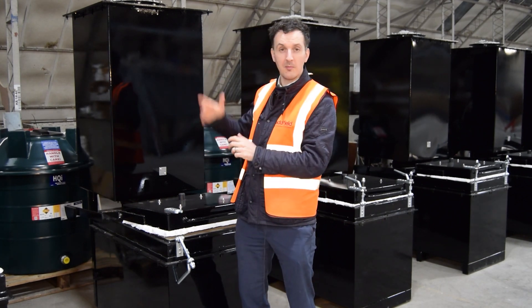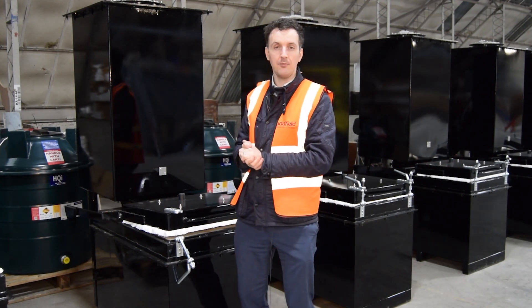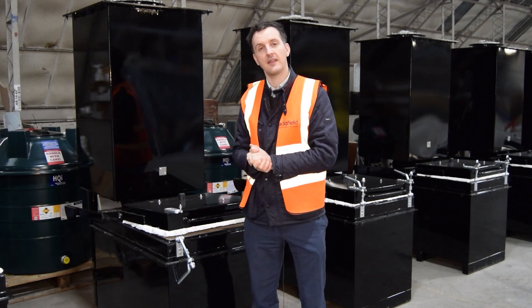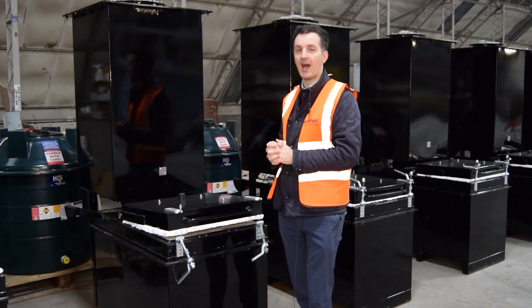On top we would normally have a chimney situated. Behind is the control panel. The control panel optimises the temperatures and timing for the unit, and the unit is designed to burn up to around the rate of 50 kilograms per hour.